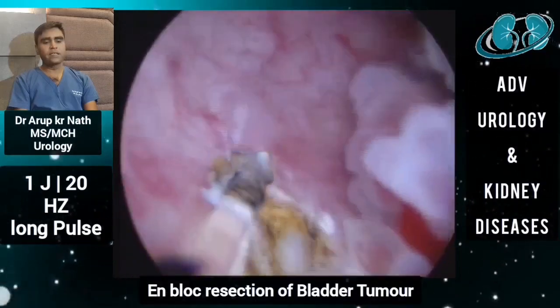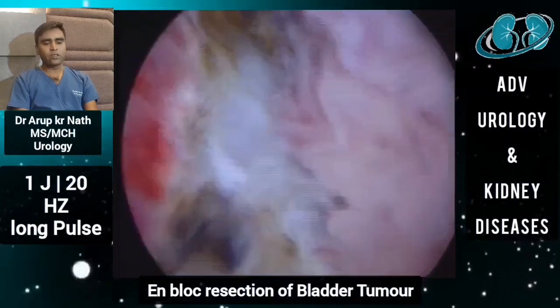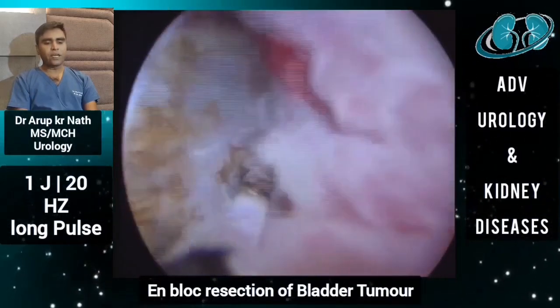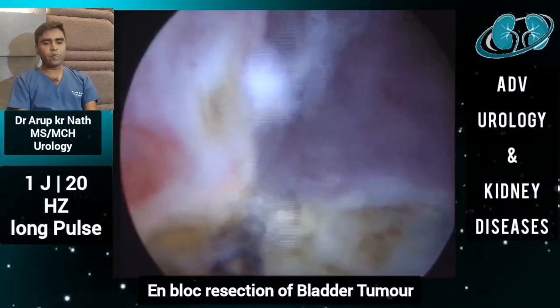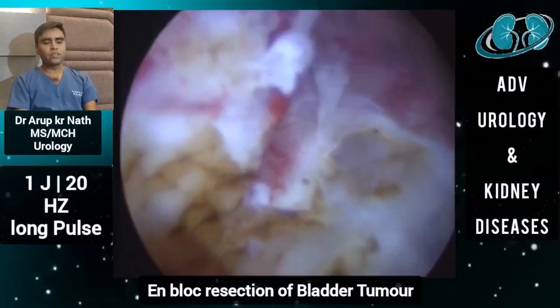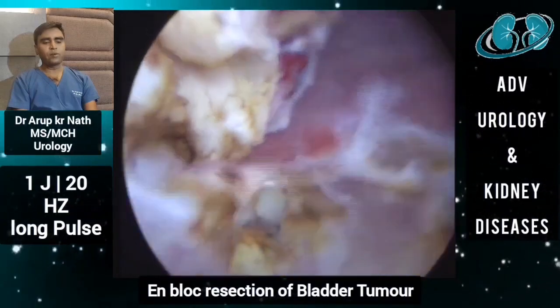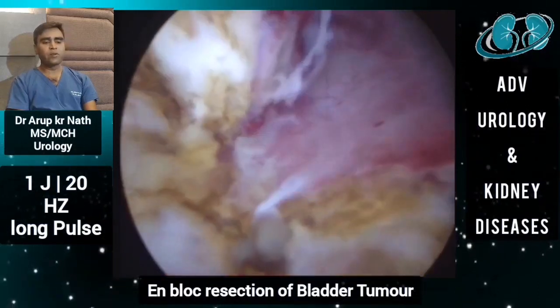There should be less chance of implantation of tumor tissue to the bladder or urethra. In our recent cases, we are not even using continuous irrigation — just placing a two-way catheter — so we are avoiding postoperative irrigation. We are performing all en-bloc resections of bladder tumor using thulium fiber laser as a day-care procedure. The catheter will be removed after 48 hours, and the patient goes home the same day.